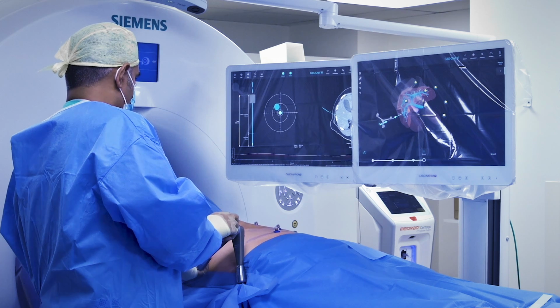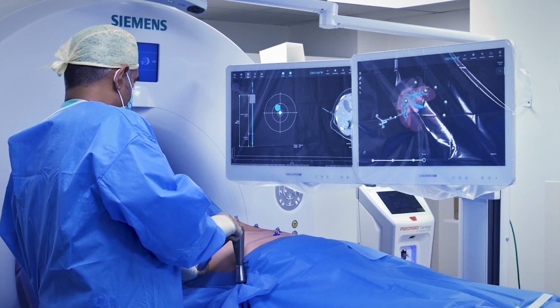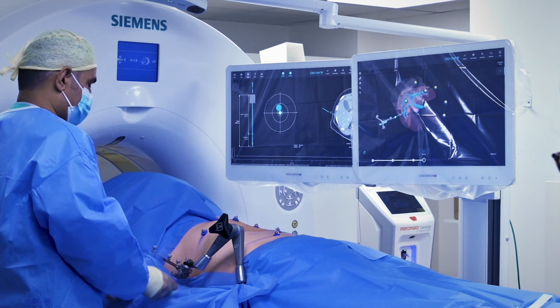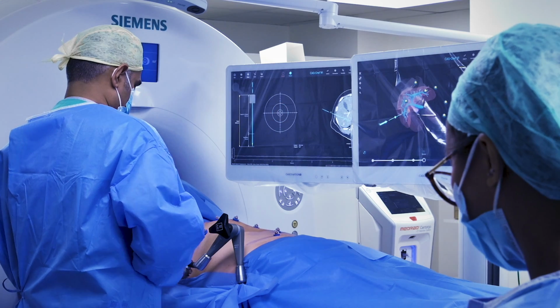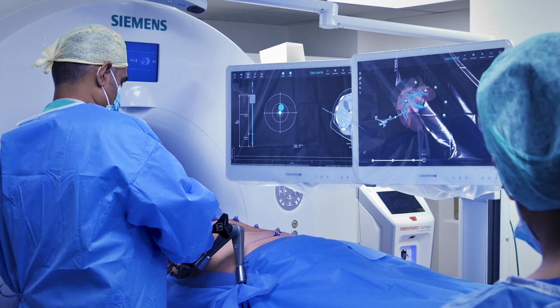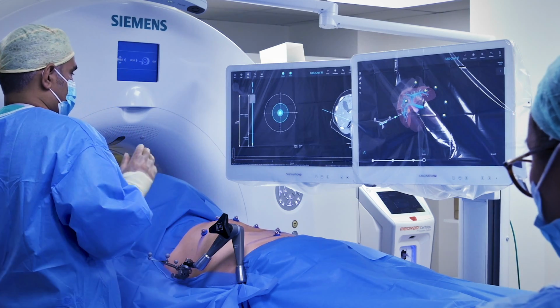Can we just hold breathing, please? So just on a breath hold, I position the little circle first, and then I'll just tweak that into there. Right, so that's pretty good there.